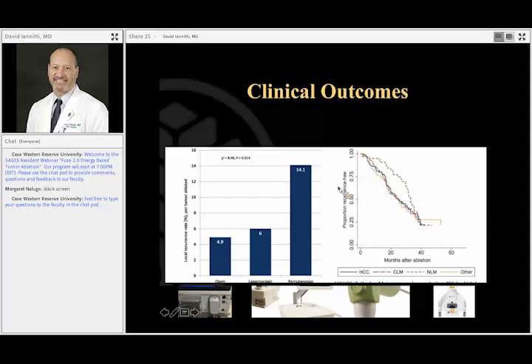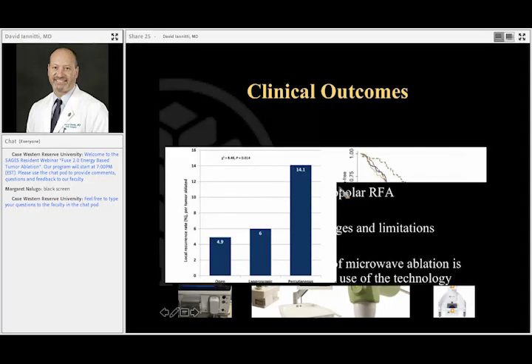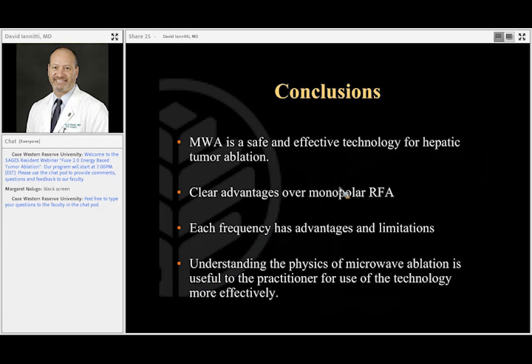So in conclusion, microwave is definitely a safe and effective technology with lots of power. Clearly from a physics point of view, and certainly we've seen from a clinical point of view, it has advantages over monopolar radiofrequency ablation. Each frequency has its advantages and limitations. The current frequency in the U.S. is 2.45 gigahertz, which I think is a good all-around ablation tool.